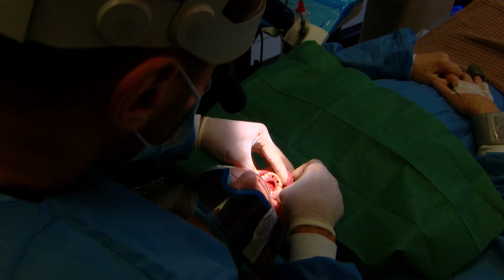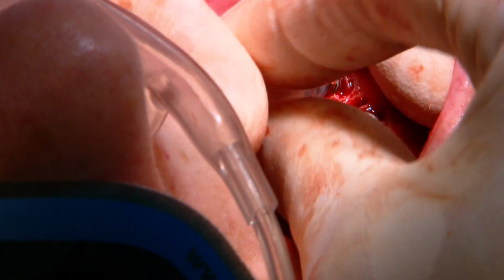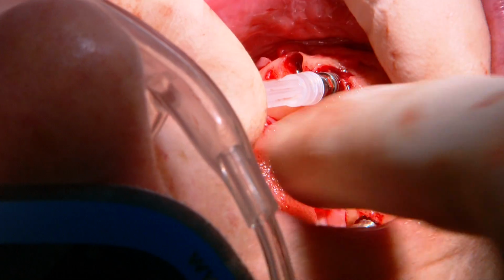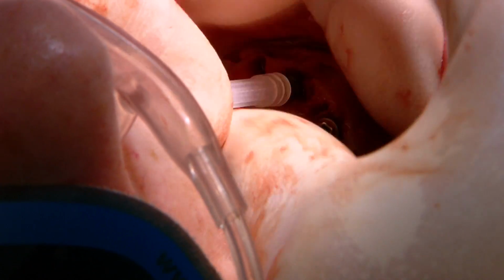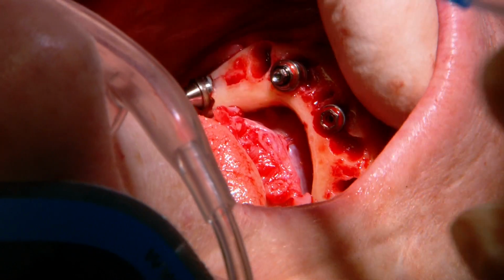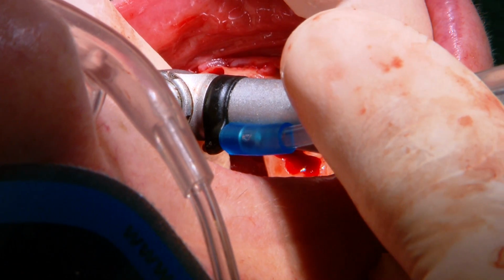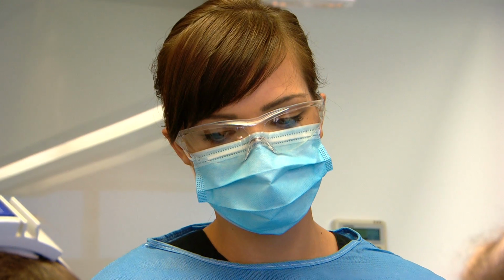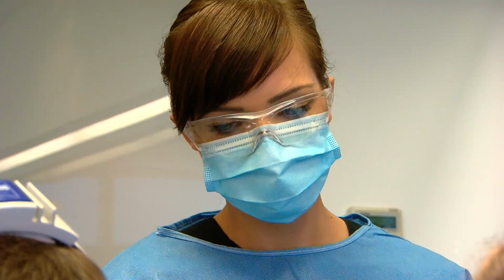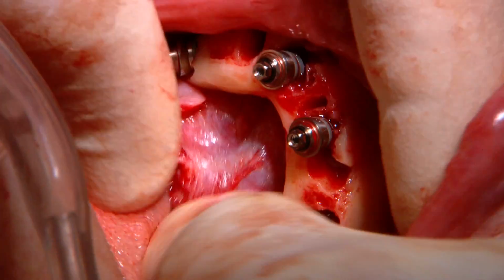Now, try the surgical guide in again and just make sure we're happy with the angles they're pointing at. These are straight abutments. These ones back here are angulated. These are at 17 degrees, these ones are straight. Put them on, and then we just torque them down so they don't get loose later on. We have our 1, 2, 3, 4 implants. The 4 connectors are placed. Bone's nice and flat and level.